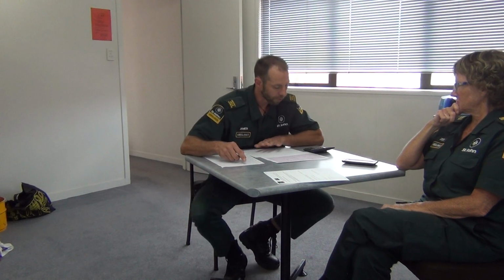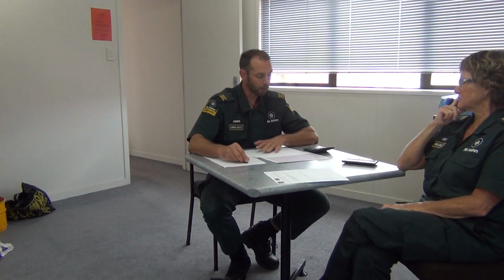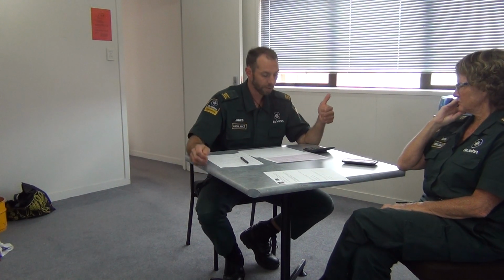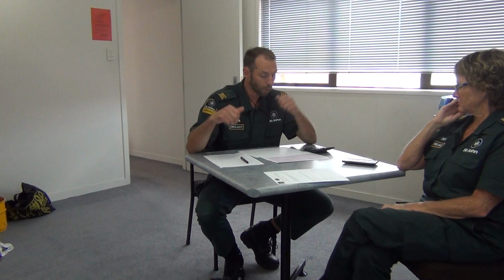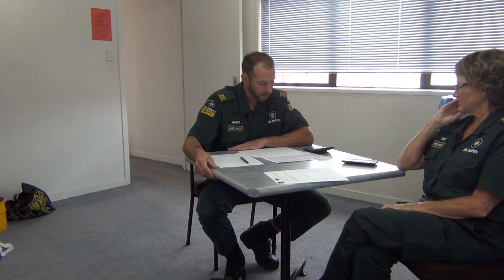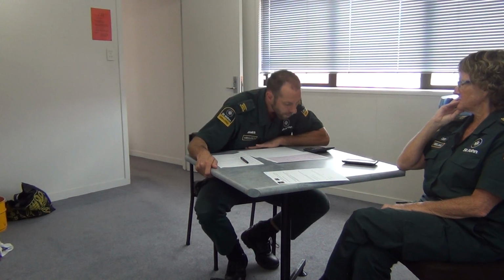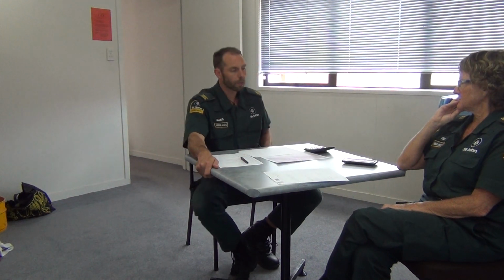I've missed one thing, which is the cardiac axis. So I'm going to use your 2 thumbs technique. So in lead 1 it's positive and AVF it's positive, so that's a normal axis deviation. Just going to look for, yep, and that's it. That's what I can see.